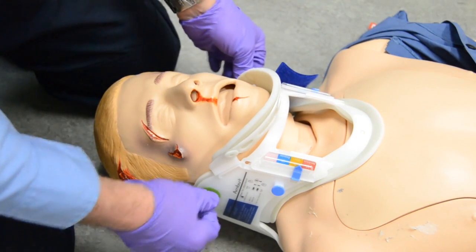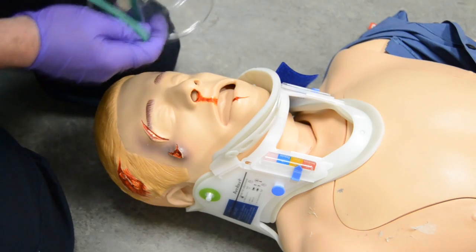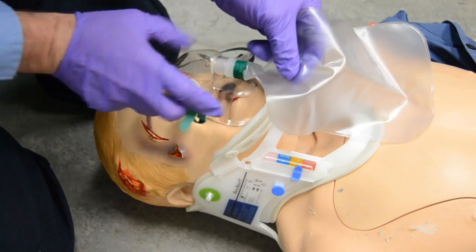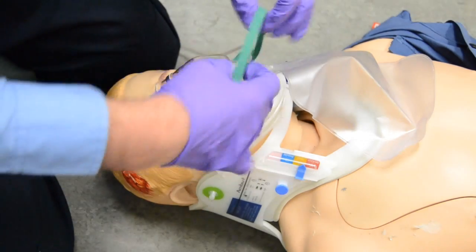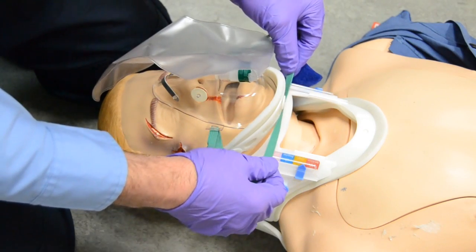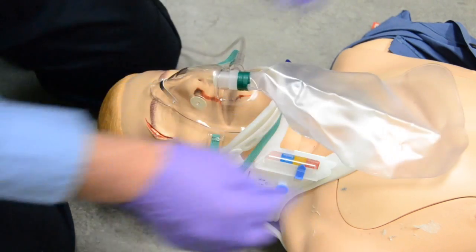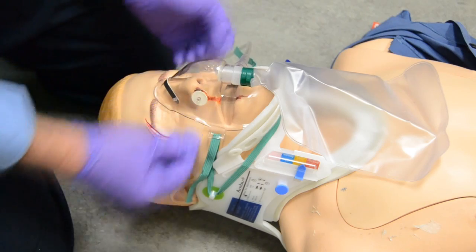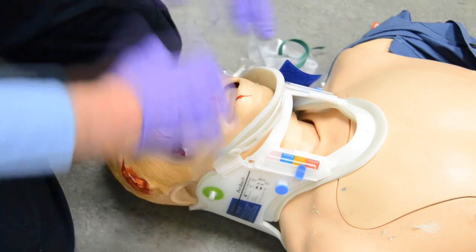Remember we talked about these little tabs here on the side of the C-collars — this is exactly what those little tabs are for, if you're not aware of why they have these little green circles to draw your attention to them. If you have a patient you need to put a non-rebreather on, once you inflate your bag and place it on the patient's face, make sure you get it snug around the bridge of the nose. Then take your strap, pull it down underneath the chin, and slide the straps right underneath those tabs. That allows you to tighten them up so you have a mask that's secure and easy to access — it's not around the head. If you need to take it off quickly, you just unsnap it.